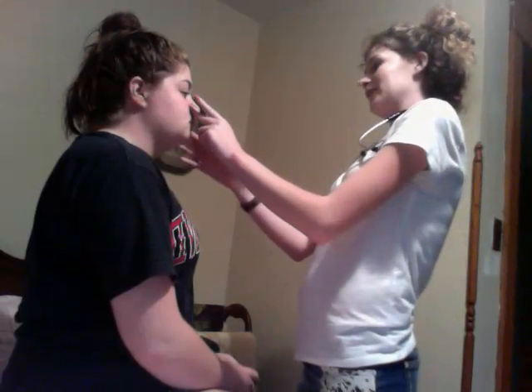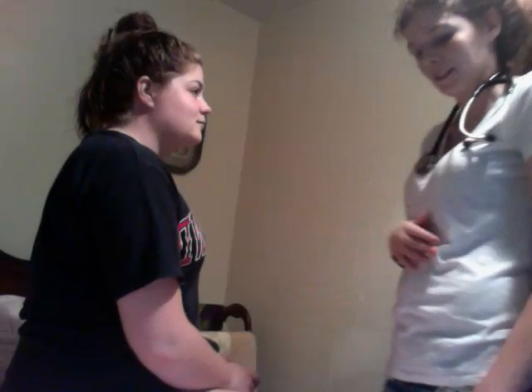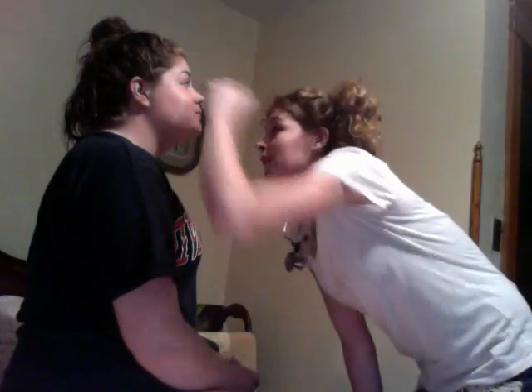And then I would have to test the patency of each nostril, so I would occlude one, sniff, then do the other side. And they're good. She's able to breathe out both sides. And then I would just use the otoscope again to look in her nose, see if there's any swelling, any polyps, redness. There's not, so that's good.